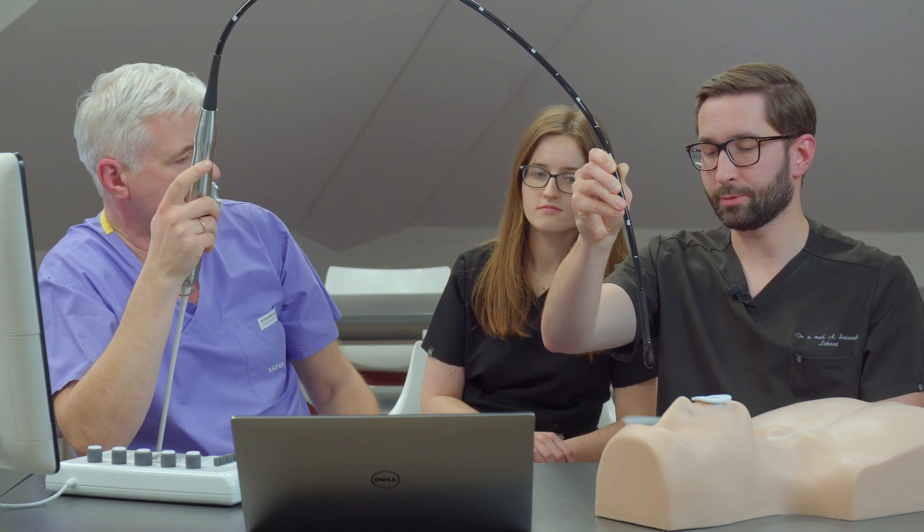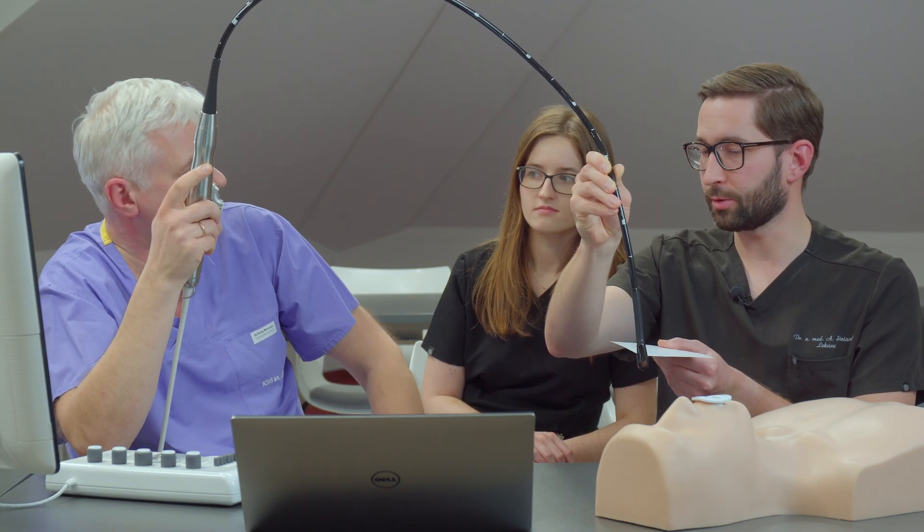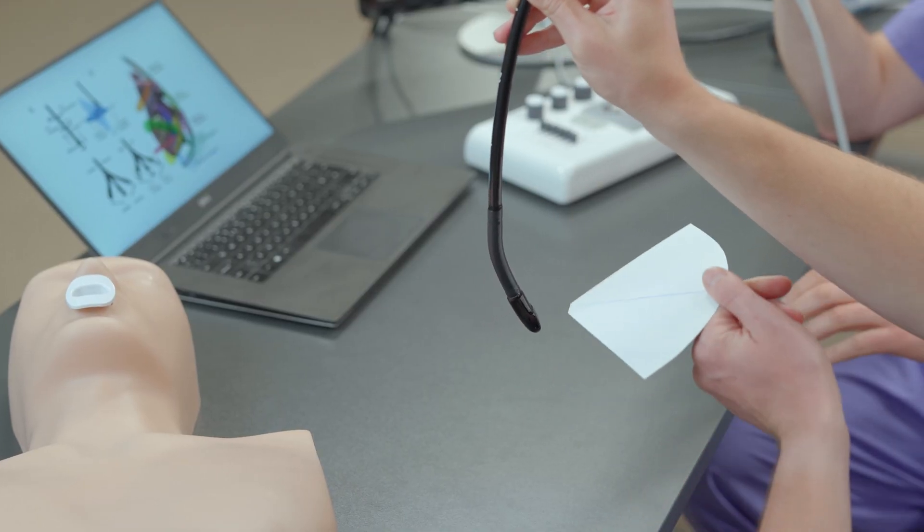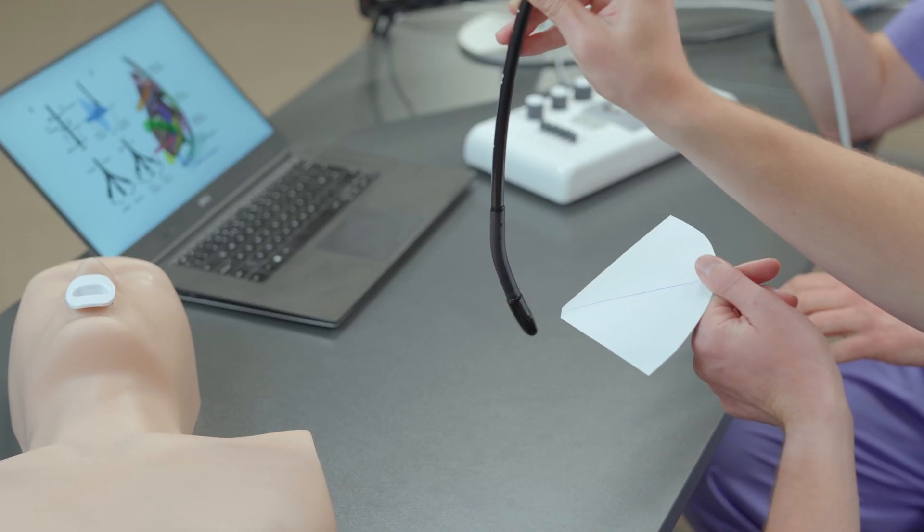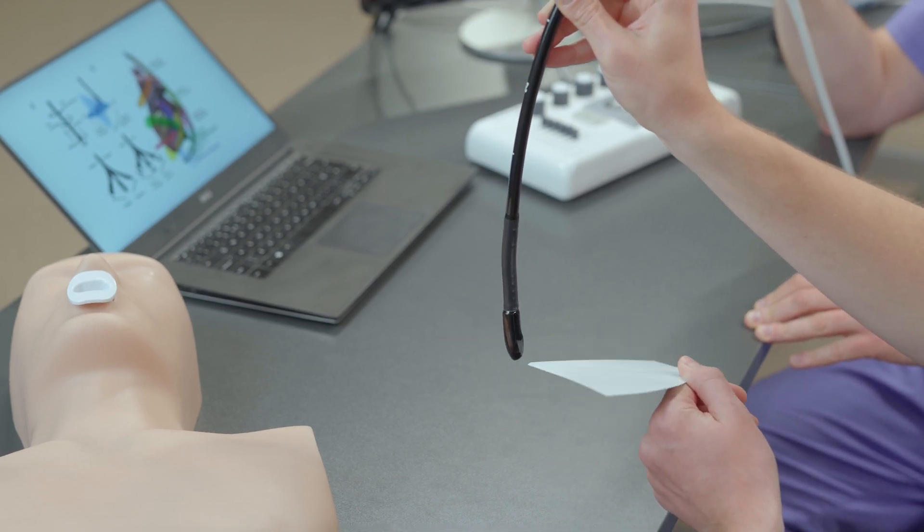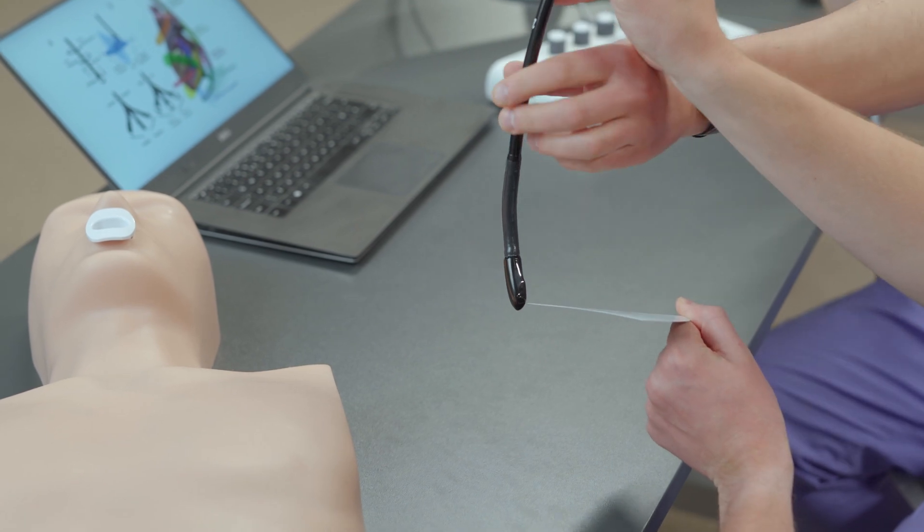So if you make the retroflex and anti-flex, the plane also changes? Yes, so if I do the anti-flex here, can you show what happens? Yes. And if I do retroflex, it goes down like that. If I do the right flex, you see, we get a little angle.